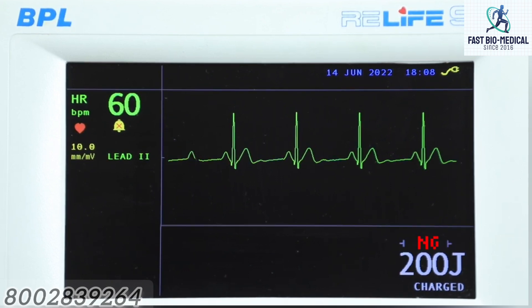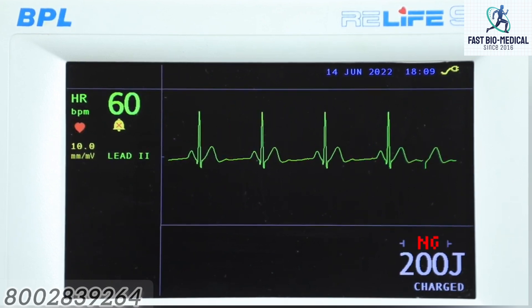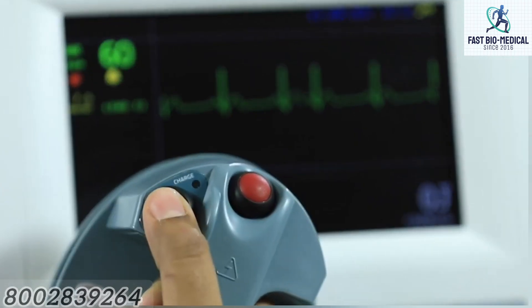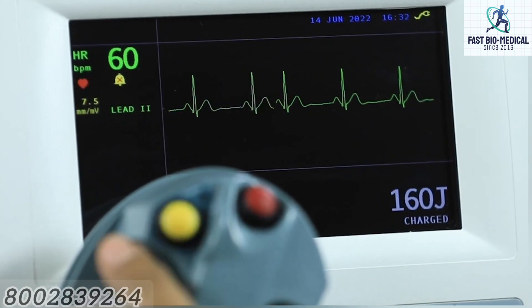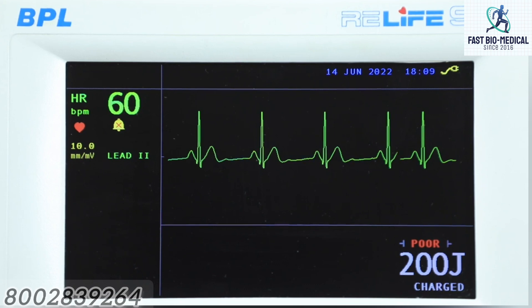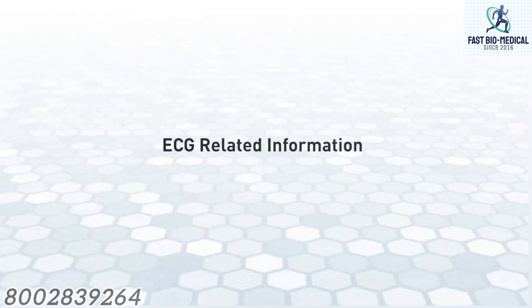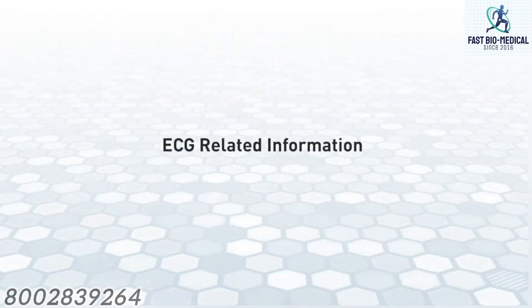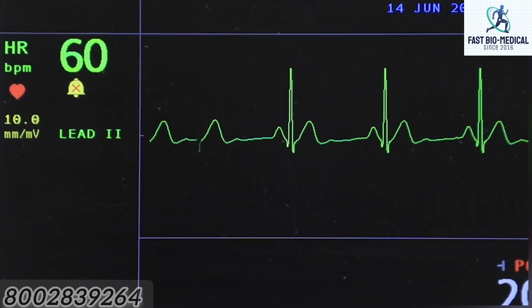Impedance information: this area displays messages related to paddle contact impedance. For example, 'NG' is displayed if the paddle contact impedance is not good — it is advisable not to deliver shock when this message is displayed. Similarly, 'Poor' is displayed if the paddle contact impedance is beyond allowable limits; at this impedance level, the energy is discharged internally.